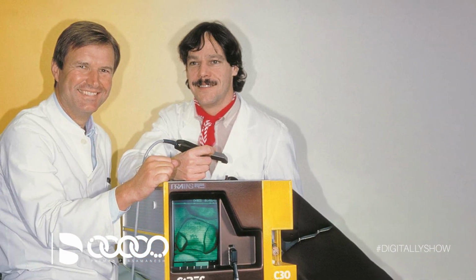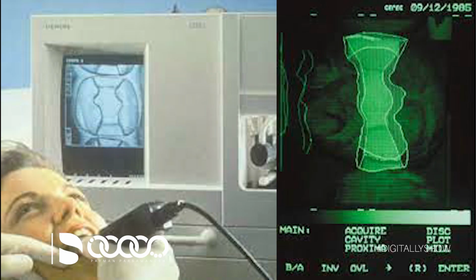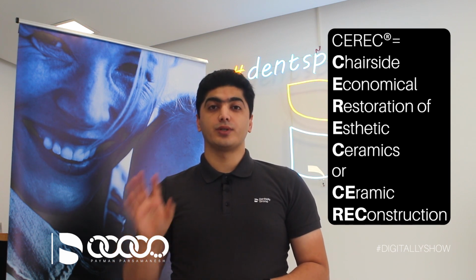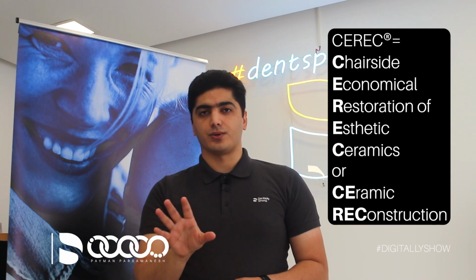He consulted with Dr. Marco Brandestini, an electrical engineer who came up with the idea of using optics to scan the teeth. By 1985, the team and Sirona company had performed the first chairside inlay using a combination of their optical scanner and milling device. They called the device CEREC prototype. CEREC is the short term for chairside economical restoration of aesthetic ceramics or ceramic reconstruction.